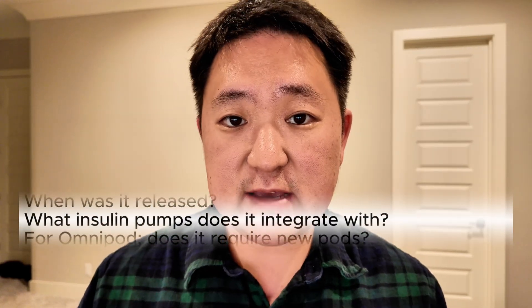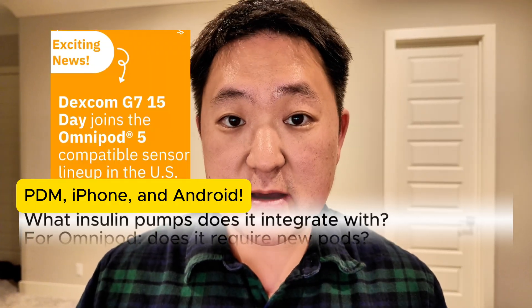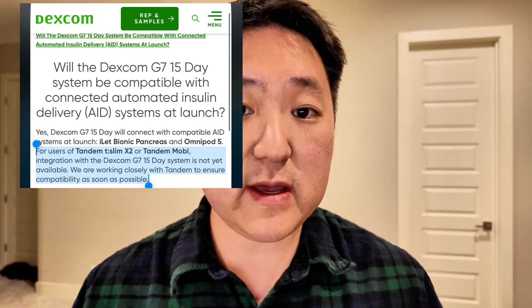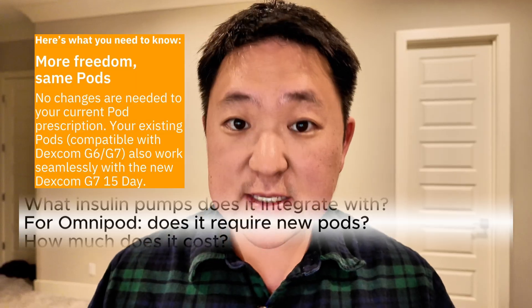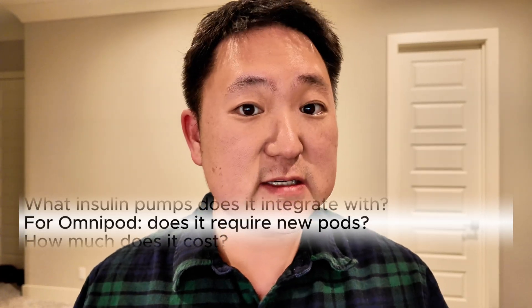At the launch of the G7 15-day version, it is compatible with the Omnipod 5 and the Beta Bionics Islet insulin pumps. Tandem has already committed to making the G7 15-day compatible with the X2 and Mobi insulin pumps, and it should be available in the next month or two. Omnipod 5 users do not need brand new pods, but they will still need to get the new 15-day version of the Dexcom G7.